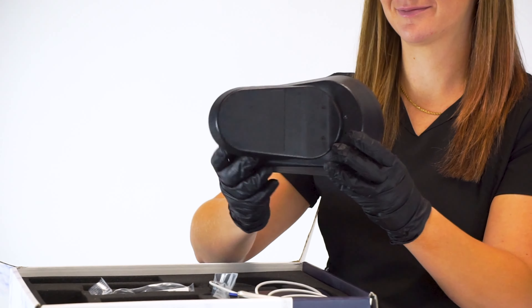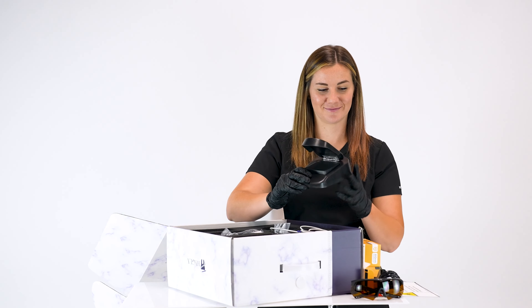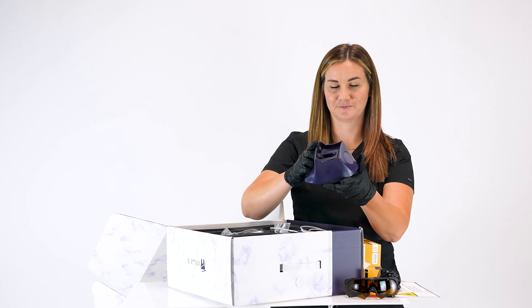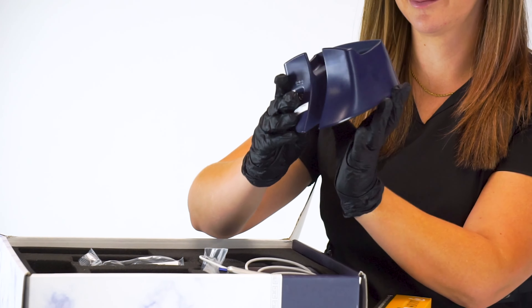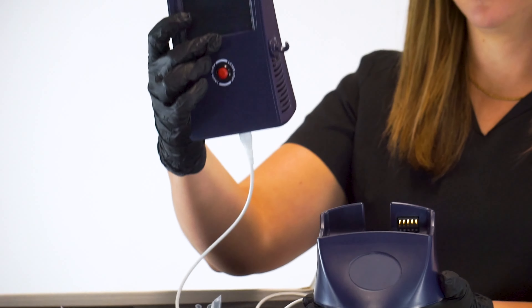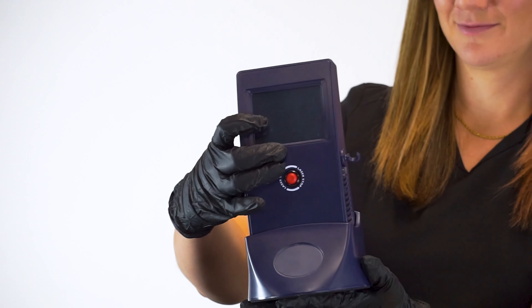One foot pedal, one charging cradle, and one Hygeia 1.5-watt diode laser with fiber cable.